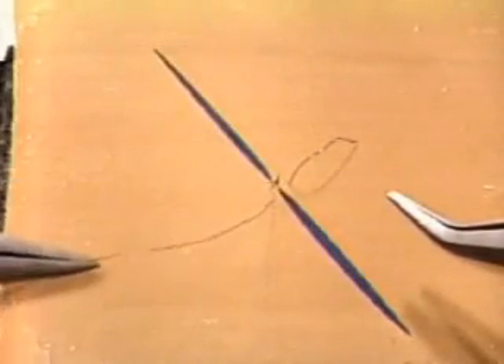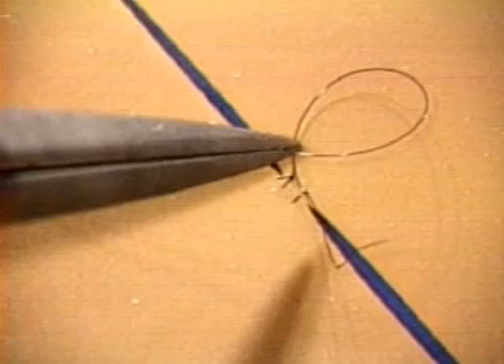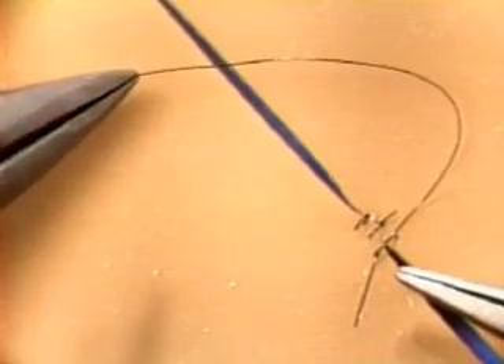From beginning to end, you don't need to let go of the thread with your left hand forceps — from the moment you first pick up the thread to the moment you finish tying the knot. It's only when you've dragged the needle back into view that you finally let go. If you're constantly letting go and picking up, you're not only wasting time but also putting numerous kinks and points of weakness in the thread.